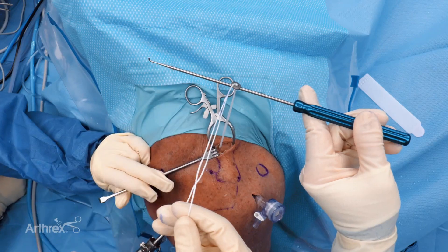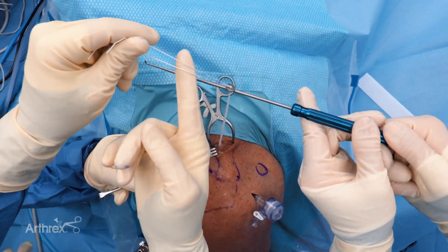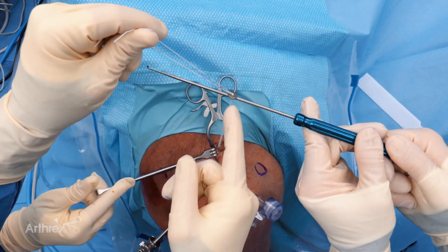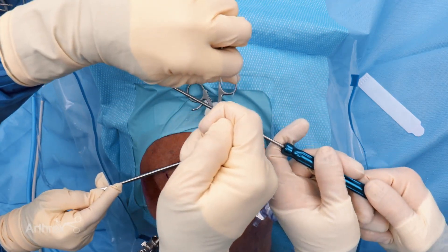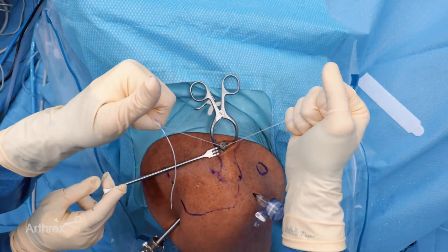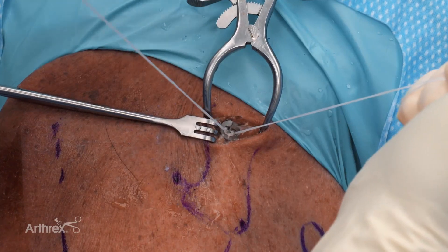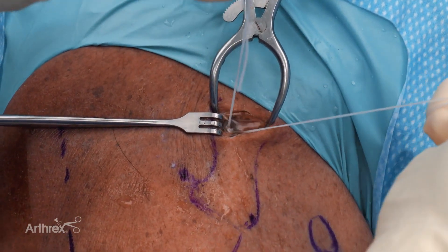Now we have our button ready to tension. We've marked the limbs of our tightrope so we can reduce symmetrically between both loops. We're getting a little counter traction with our probe, which gives us the ability to control the reduction of the button onto the clavicle. I'm going to pull an equal amount, walking this back and forth until we get close enough to the clavicle. Now we've got the button almost down to the clavicle. I'll use the axis on the laser line to line up my button in relation to the long axis of the clavicle, and once I'm happy with where it is, I'll give it the final tension.